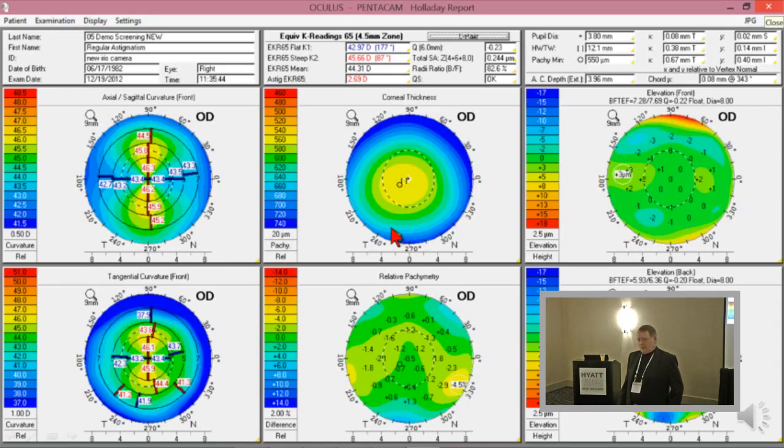So here's what happens. When you look on that EKR65, if you see between the 4.5, the 4, and the 3 millimeter zone, that power drops down by almost a diopter post-refractively, well then, yes, I would edge towards the 3 millimeter because you know that person has a multifocal cornea, and that if you use the 4.5 millimeter zone, you may end up a quarter or a half a diopter hyperopic.